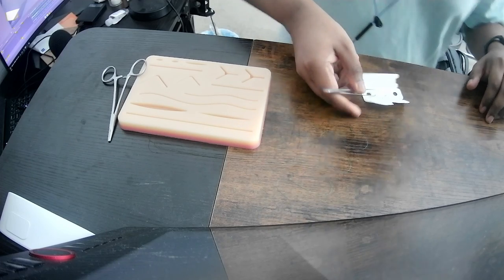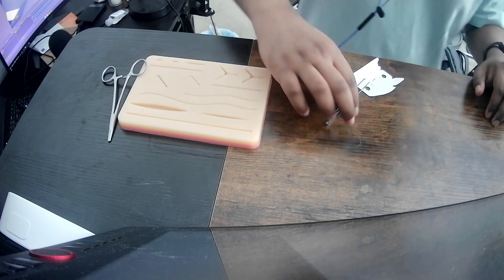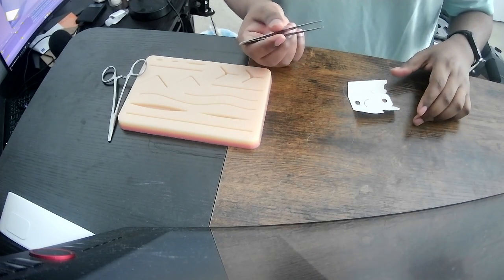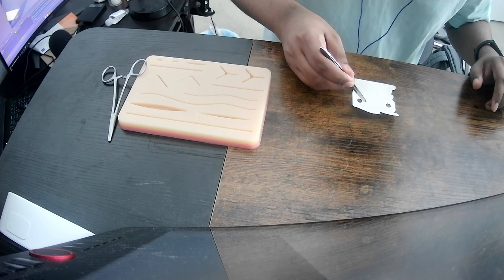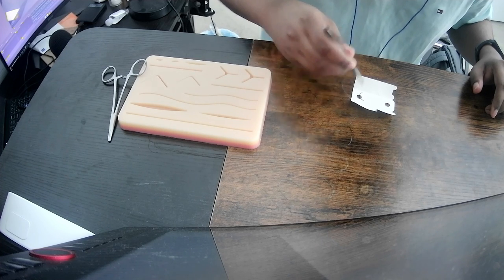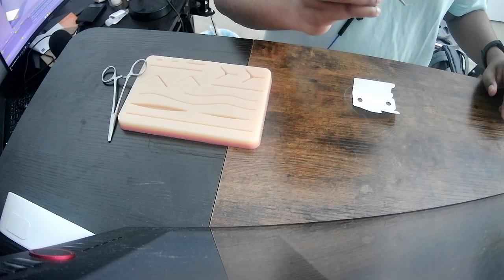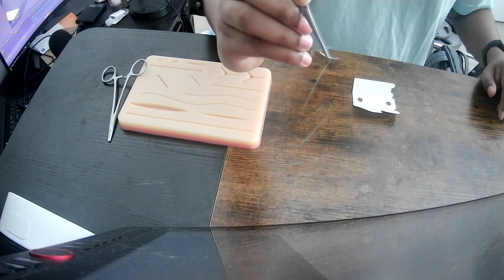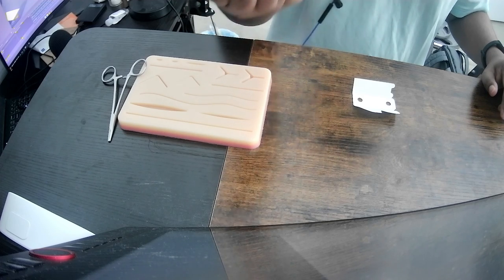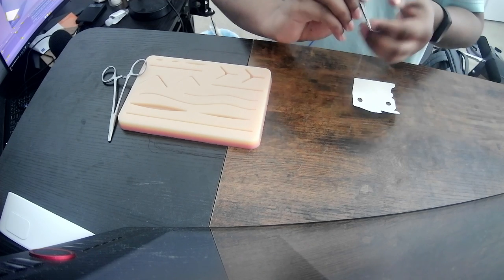I don't know. Let me see how they did it in the video. Although this guy's a pro. And again, what you'll probably have to do is load the needle driver. Now sometimes the scrub tech may hand you it loaded. You want to be prepared for being able to load your own needle driver for a number of reasons. Number one, you may not have someone hand it to you. And number two, someone who hands it to you may not have loaded it properly. So this is where everything kind of comes together.